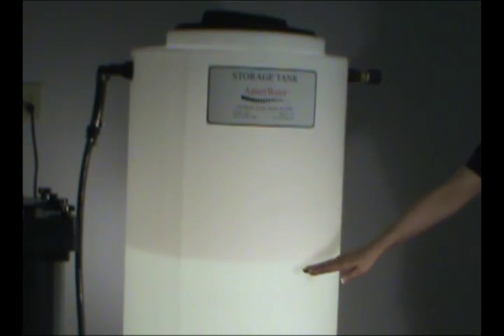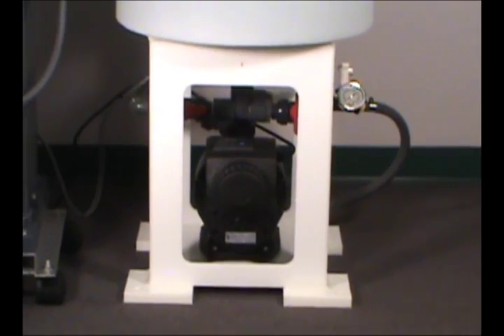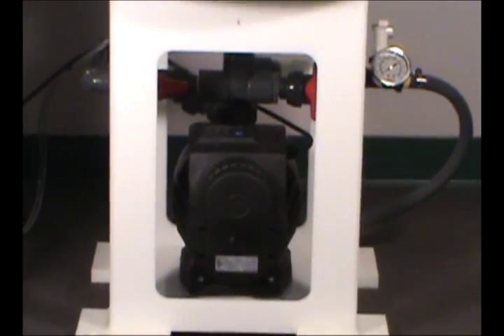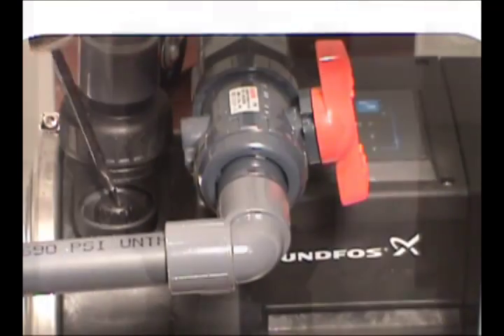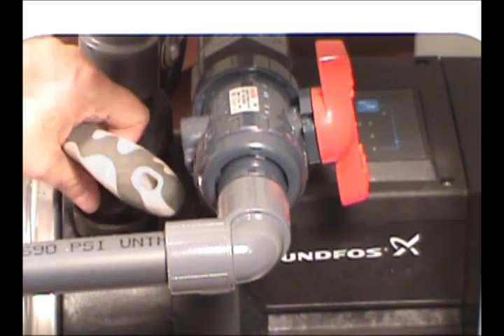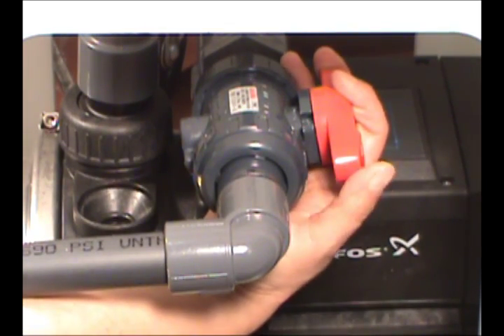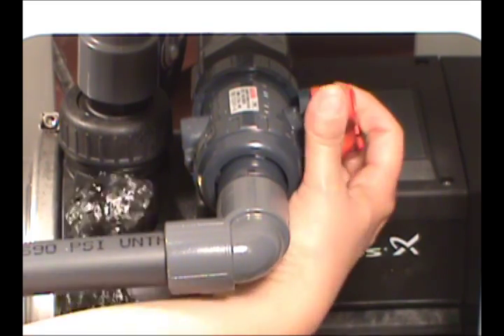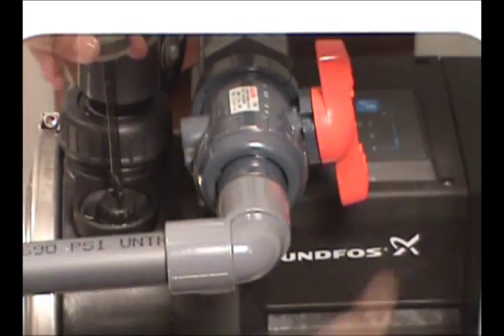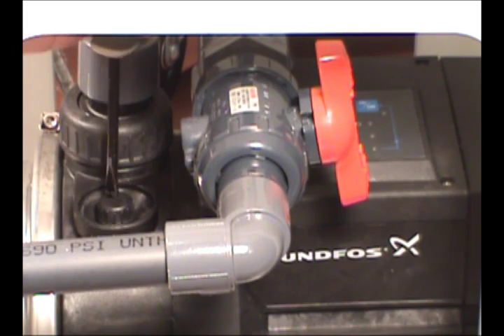When the storage tank is half full, it's time to prime the distribution pump. The distribution pump is located at the base of the storage tank. Remove the priming plug from the top of the pump. Slowly open the feed valve to the pump. After the pump chamber has filled with water, turn off the valve and replace the plug.